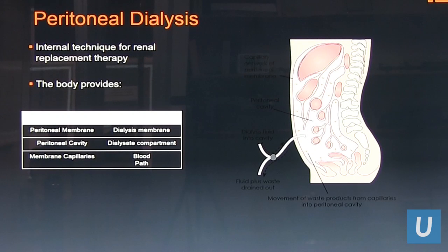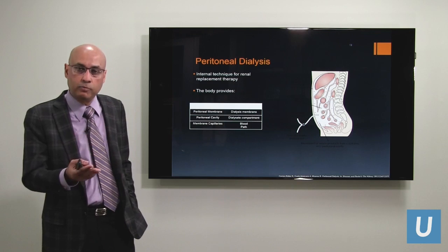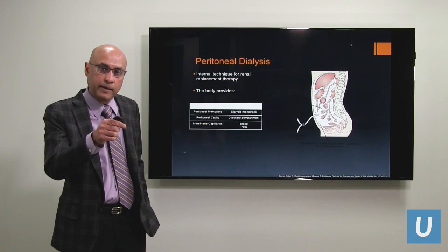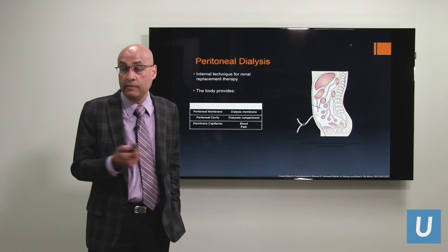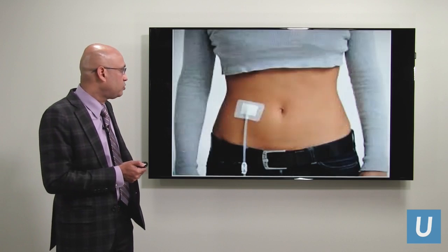And what we normally do is once you're trained, we give you a machine, and a lot of patients prefer something called a cycler. You go in at night, you connect yourself to the cycler, it dialyzes you at night, and the drain comes out into the drain bag. Now, there's also something called manual, and we'll be discussing this in a lot more detail in our future webinars, in which you don't use a cycler, but you actually manually hang the bag, and you keep on changing the bags as you dialyze. So it's a personal preference. Some patients like the manuals, some like the cycler. And like I said, we'll be discussing this in a lot more detail in our future webinars.